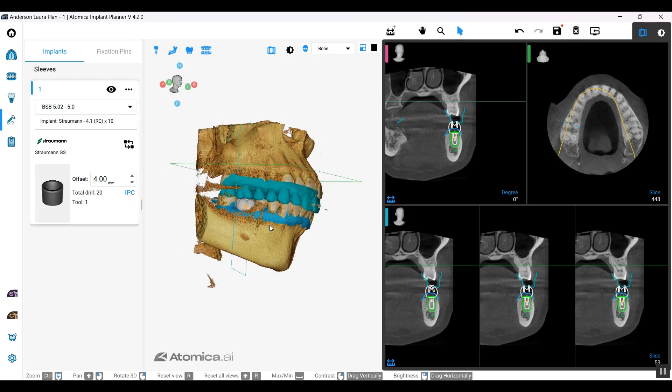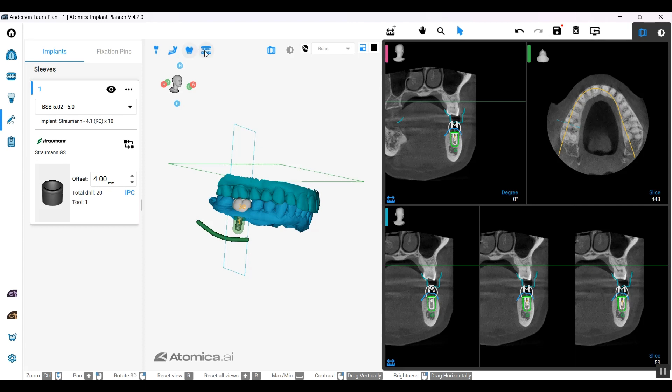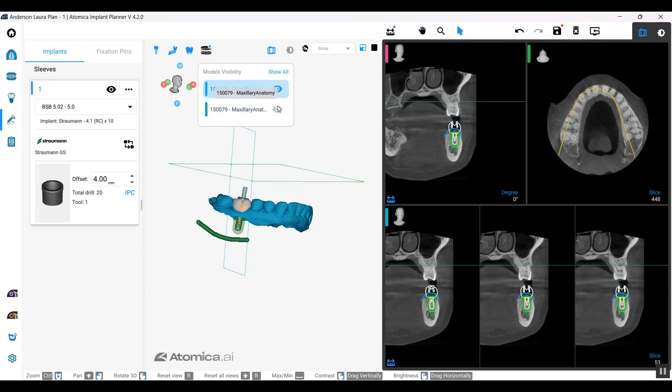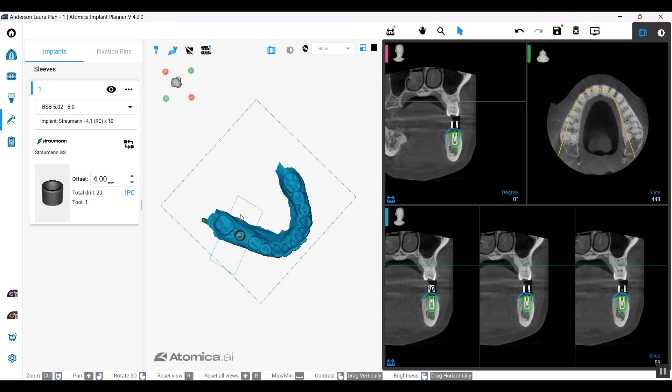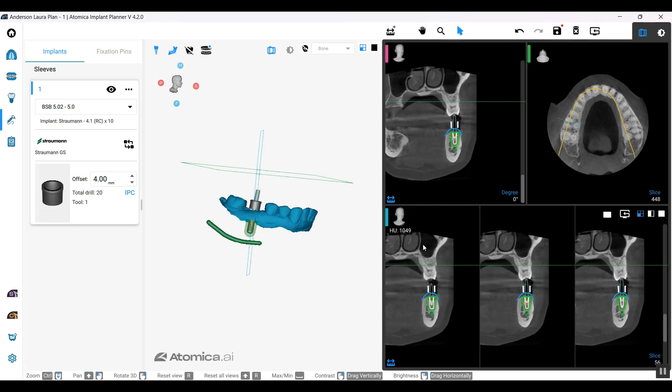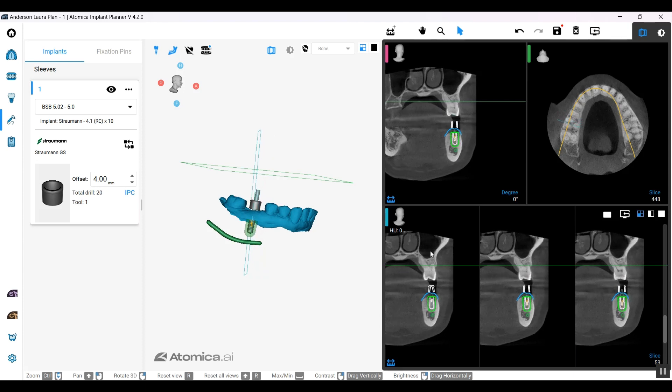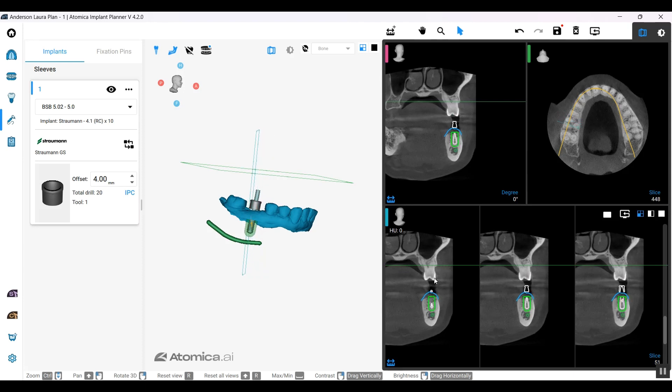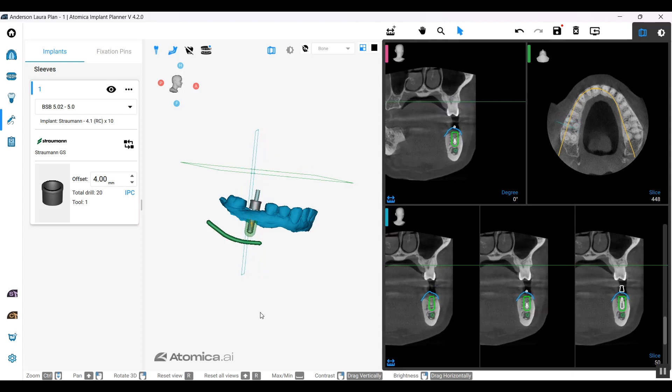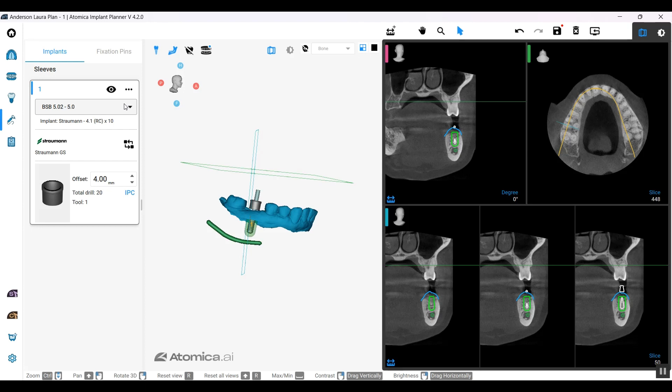The IPC icon right there resembles Implant Placement Control. I can check my sleeve through the 2D as well. When I'm done with this, you can also add generic sleeve which might be compatible with the system that you selected.